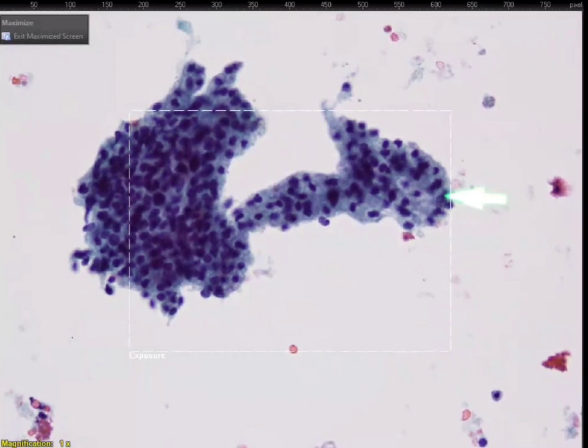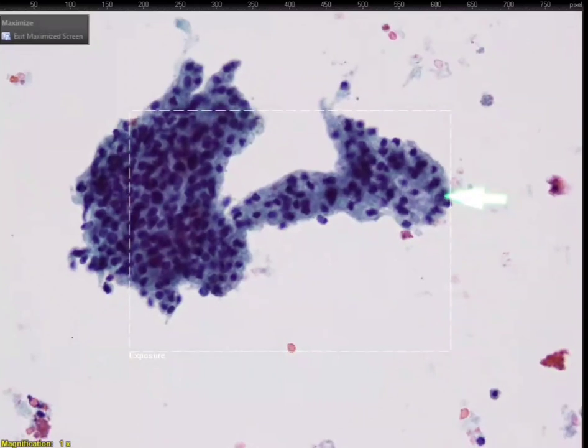Yes, and from lung, that is also TTF1, right? So we might need history, perhaps some imaging, CT, if there's some mass somewhere, that might help us out. But everybody comfortable with this being a definite second population of cells which are now abnormal, right? Okay. Good.